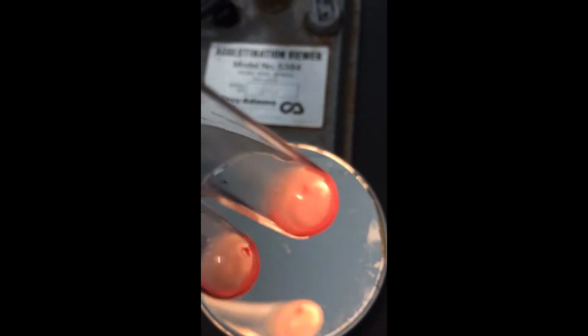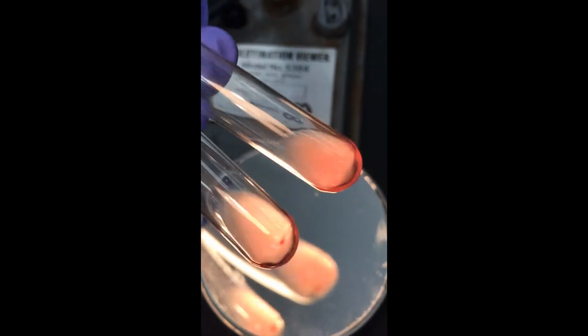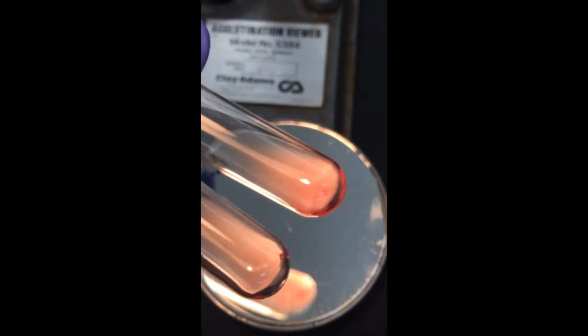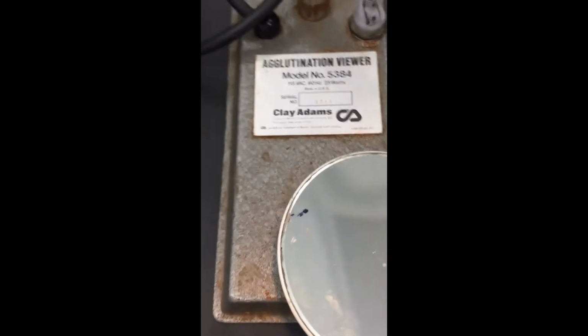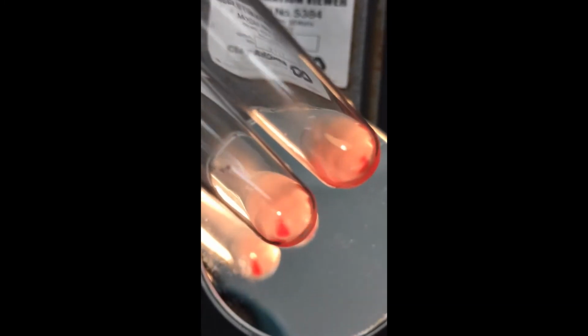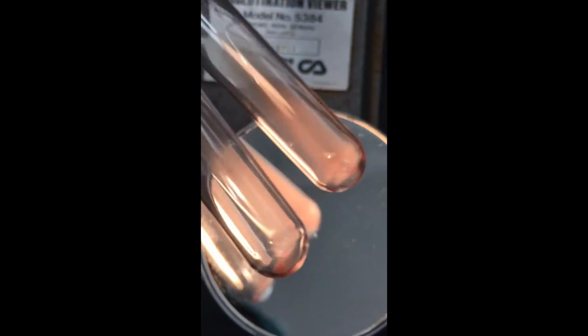Longer to get those cells off. Tube 7 and tube 8. Tube 9 and tube 10. Tube 9 is on the bottom or the left.